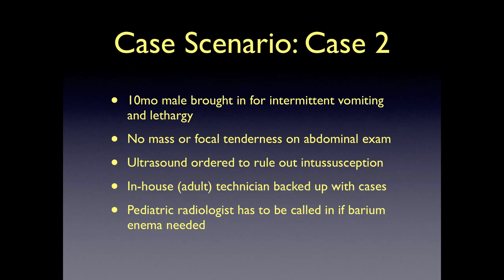In the second case, you have a 10-month-old child brought in for intermittent vomiting and lethargy. There is no mass or focal tenderness on abdominal exam. Though these are not the classic textbook presentations, you have a moderate clinical suspicion for intussusception and order an ultrasound. There is an adult ultrasound tech in-house, but she's backed up with cases from the rest of the emergency department. The pediatric radiology attending has to be called in from home for barium enema if an intussusception is found.